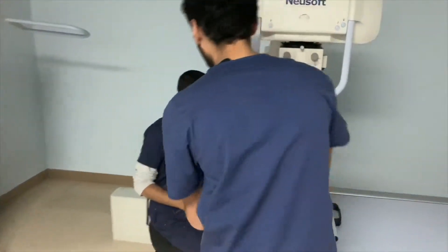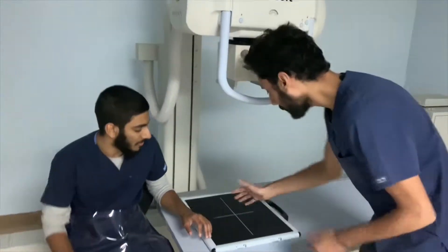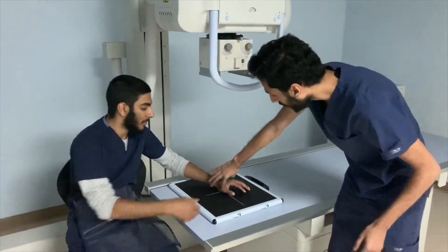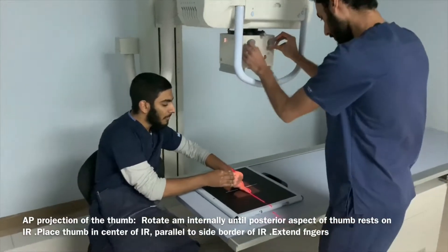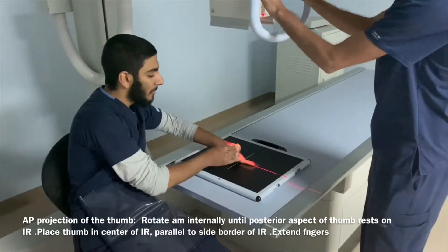The technologist is demonstrating the position rather than physically interfering, to avoid causing any further damage. He's also made sure the patient's feet are away from under the table. Then he's adjusting the collimation vertically and horizontally accordingly. The technologist instructed the patient to look away for protection measures.